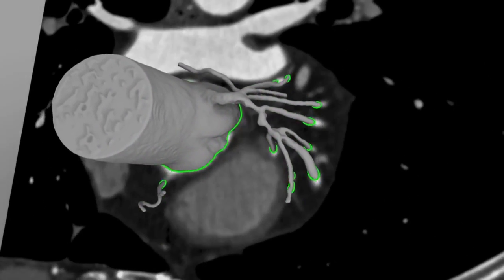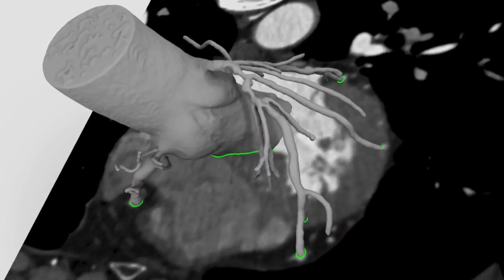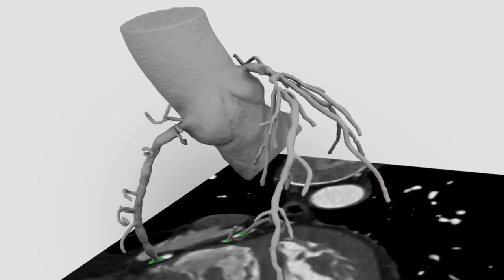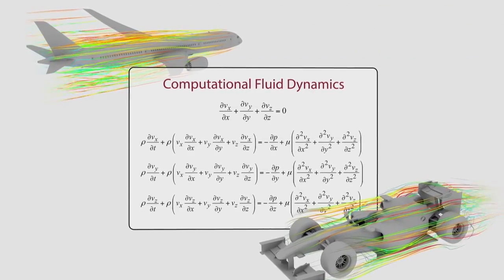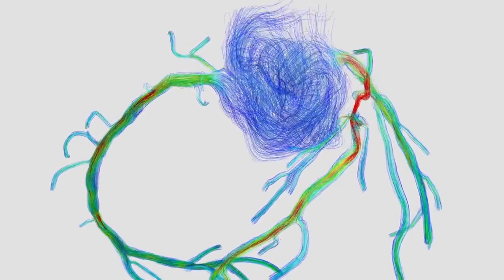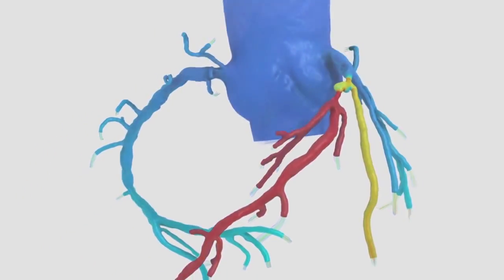From the CT images, HeartFlow creates a complete geometric and physiologic model of the patient's unique coronary anatomy. Next, the scientific principles of computational fluid dynamics are applied to model the complexities of fluid flow.